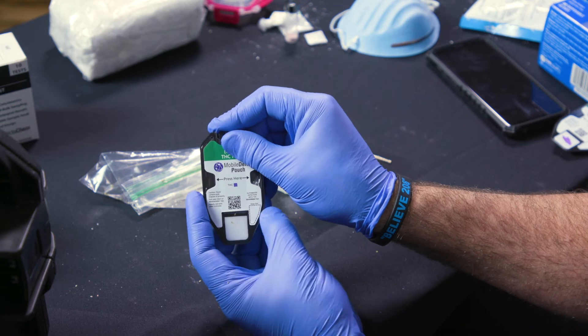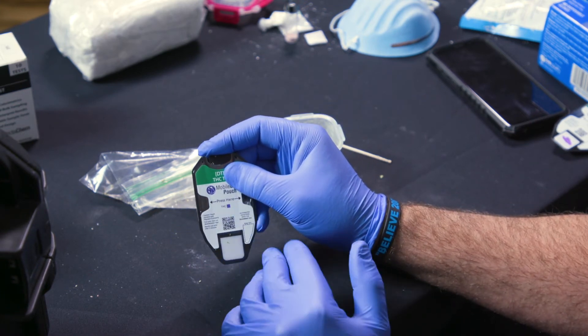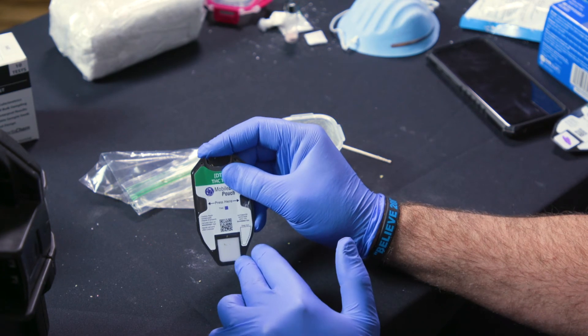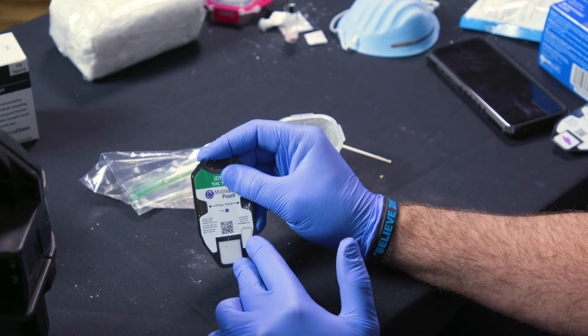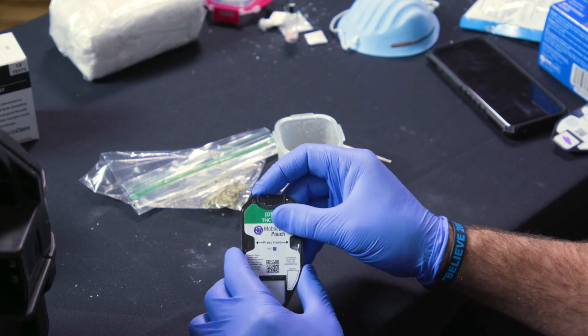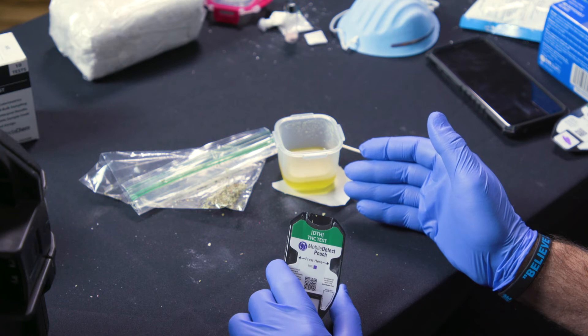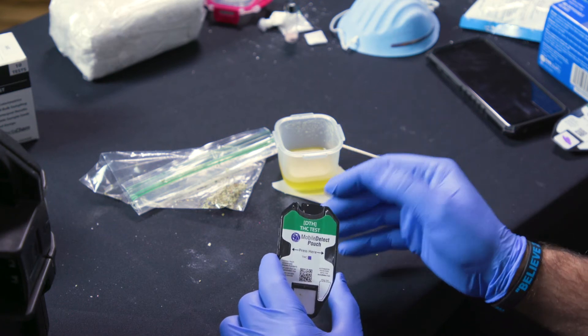Once that's down there, you may need to wait up to a couple of minutes to start seeing that purplish — the bluish-purple reaction on here. Especially if it's plant material, it just needs to break down part of the organic material. If you had dab or shatter or something a little more concentrated or in liquid form, it might go a little bit quicker.